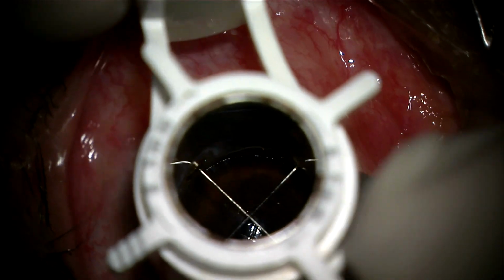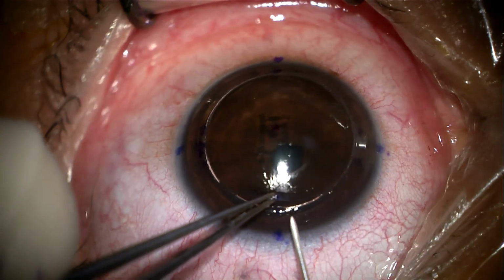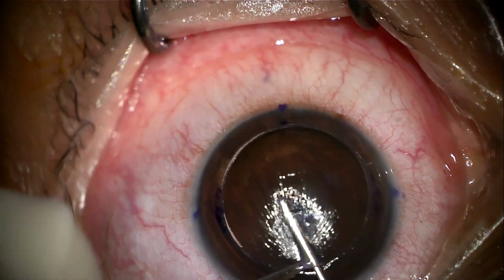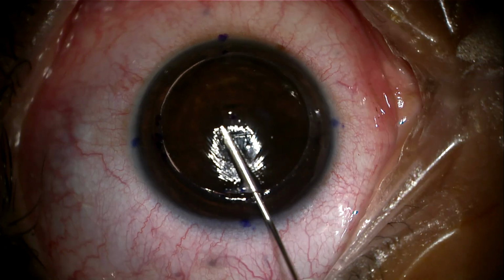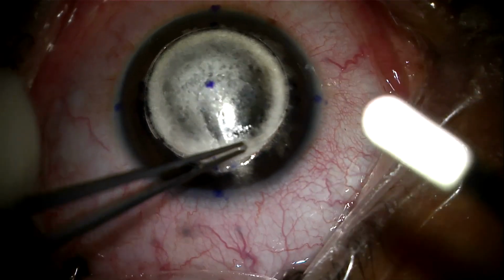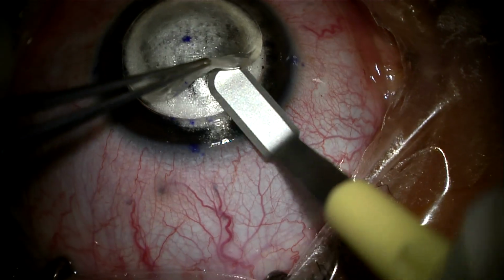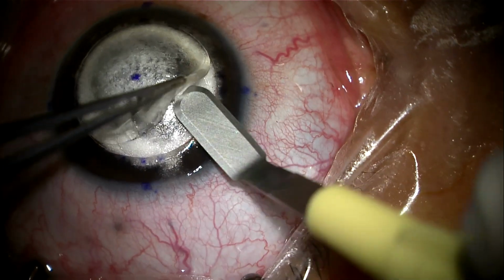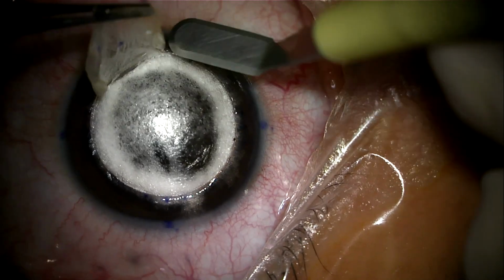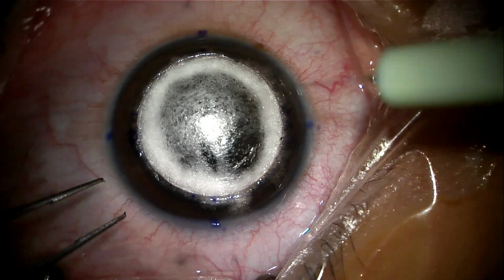This is followed by introducing a bent insulin 27 gauge syringe in the mid-stroma. Do not attempt very deep introduction of the needle, except if you have one of the commercially available blunt air injection cannulas. Air is then slowly injected into the corneal stroma, and you will see the signs of big bubble formation, which is a circular white opacity extending from the center to the periphery, stopping at or before the trephination groove. This is followed by superficial keratectomy, removing the superficial layers of the stroma.